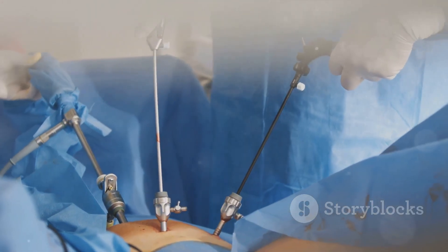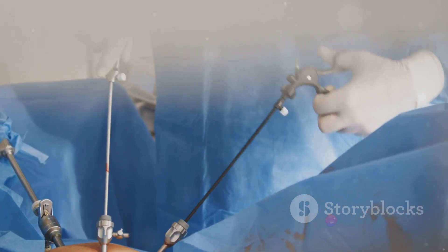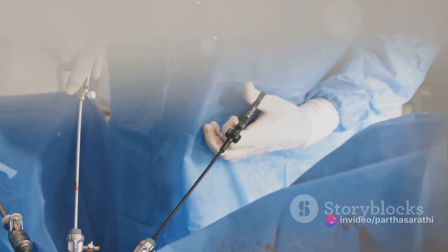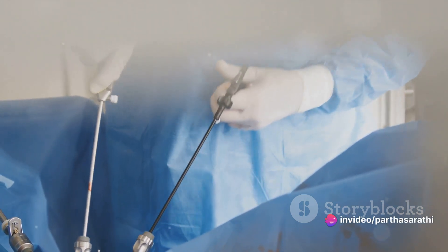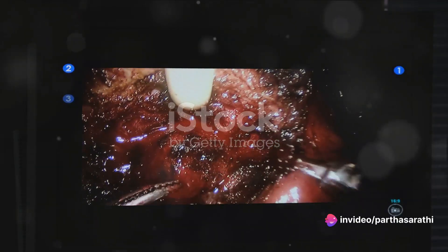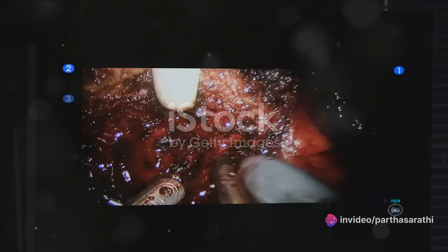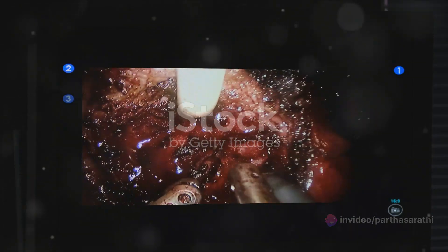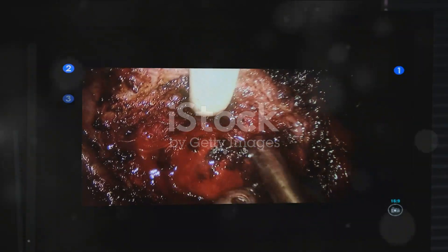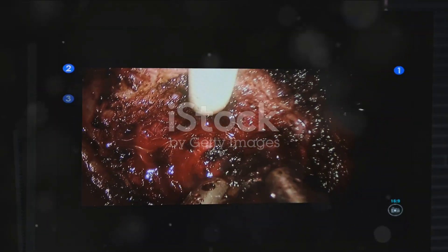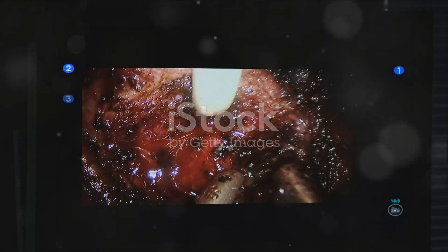With the patient under anesthesia, the surgeon creates a small incision, typically near the navel, to access the fallopian tubes. In some instances, laparoscopic techniques are employed. These involve a thin, lighted tube equipped with a camera, known as a laparoscope, being inserted through the incision.